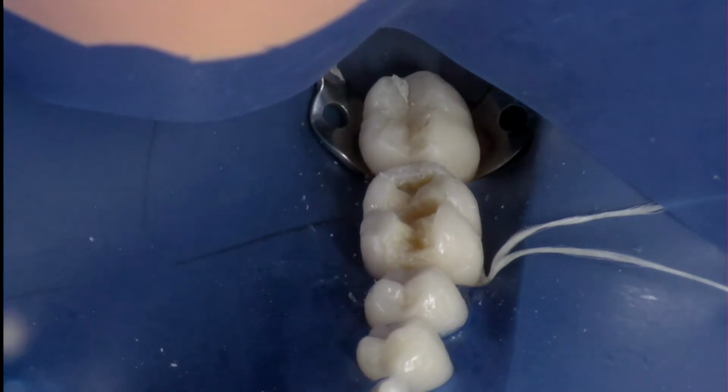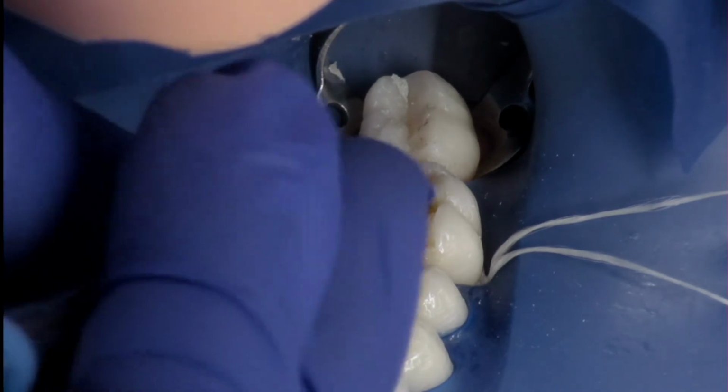Here I am trying to bring that triangular ridge a little bit to the mesial just to give it more of a natural feel.